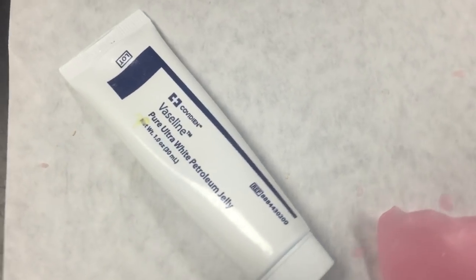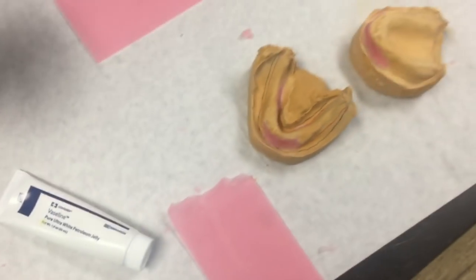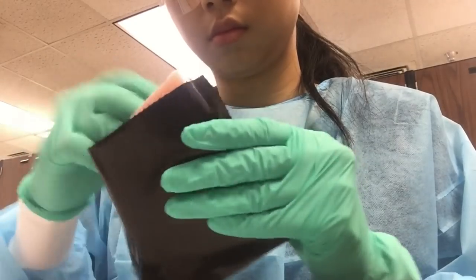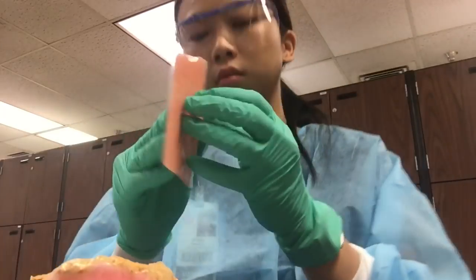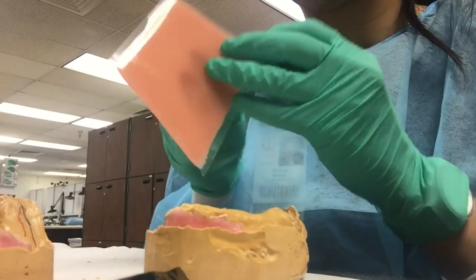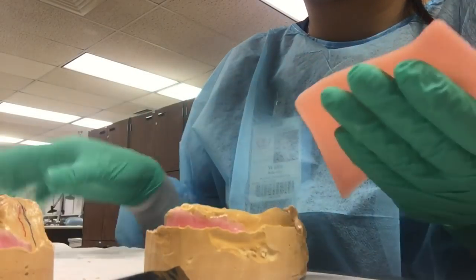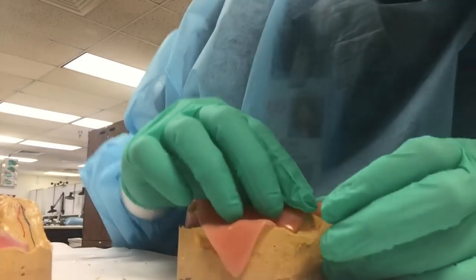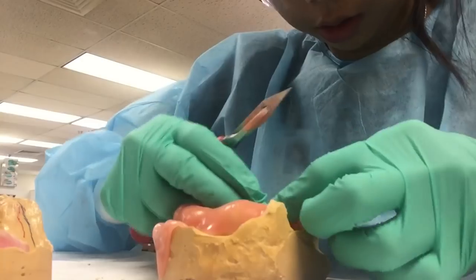Moving on, I'm applying Vaseline on top of the stone with the wax, and then I'm opening up the triad tray material. It kind of reminds me of Kraft single cheeses in their little plastic wrappers. The pink color is usually more for denture bases, but I went ahead and used it anyway. I'm placing it on and making sure it follows the curvature of the stone model.